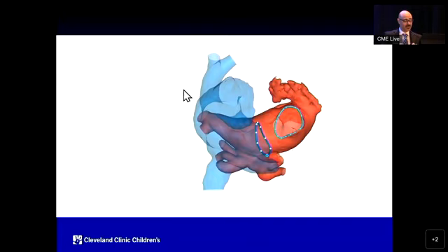So this was the $1 million picture when we looked at it and when we held the models. This is the systemic veins. This is the pulmonary venous atrium with the weird pulmonary veins in the back. This delineates the tricuspid valve location. This delineates the mitral valve location. And after looking at this with Dr. Najim for hours, we figured that there was no meaningful way to create intra-atrial baffles and partition these atria. Not even a hemi-Mustard would be feasible.